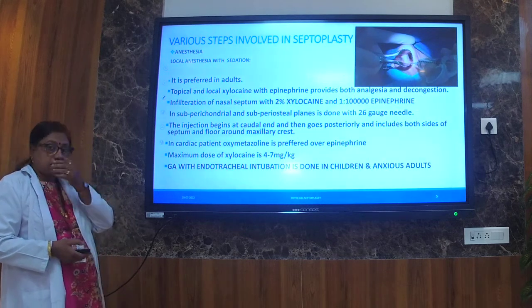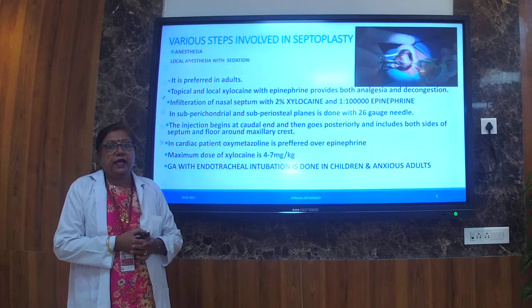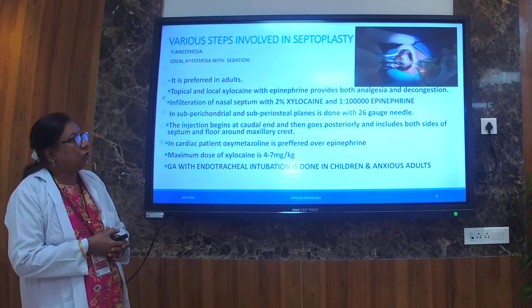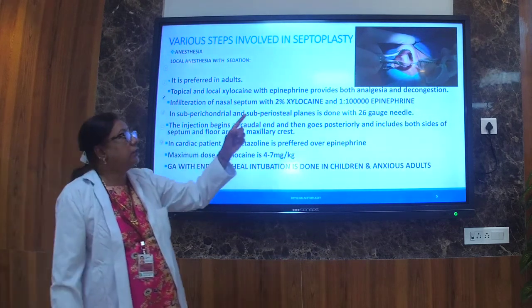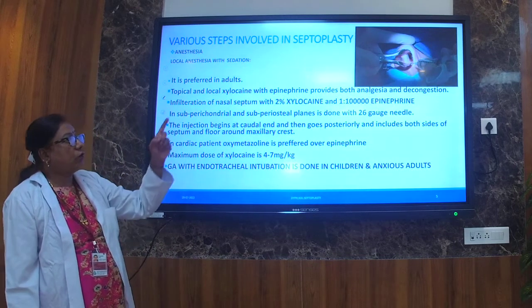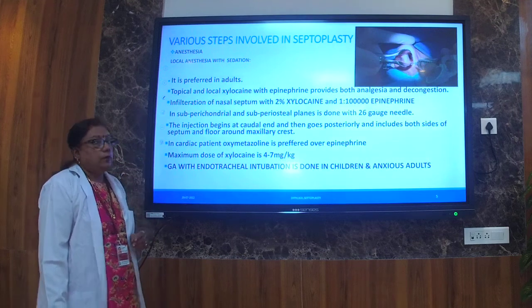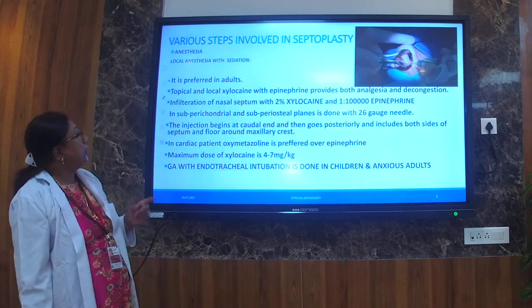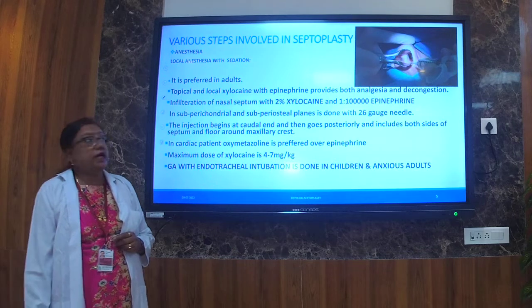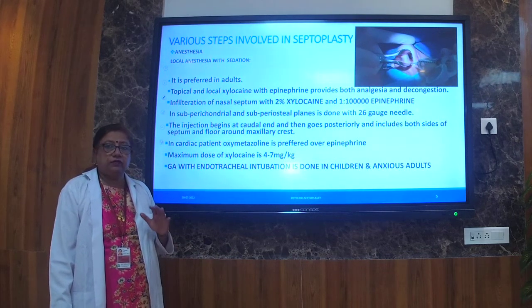Now we will discuss the procedure, what are the various steps of septoplasty, okay? The figure you see shows the procedure of the open technique. It is usually done under local anesthesia with sedation. Okay, it is done under local anesthesia with sedation.